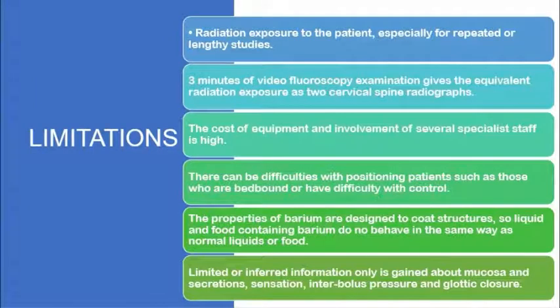And there are other limitations for the use of video fluoroscopy in general and the penetration aspiration scale in particular. There is, of course, the risk of radiation exposure. Three minutes of exposure to video fluoroscopy is equivalent to a radiation exposure of 2 cervical spine radiographs. There is the cost involved in the equipment and in the personnel. There is also the difficulty in positioning the patient for the test, particularly if the patient is bedridden, for example, or after generalized neurological problems.